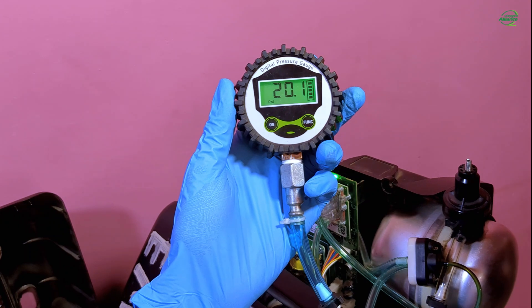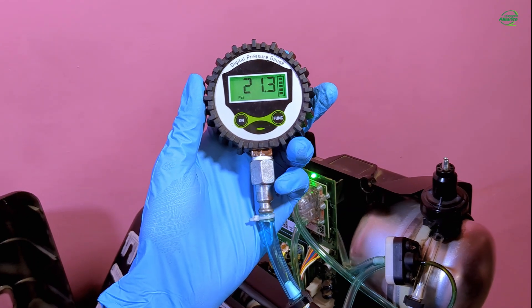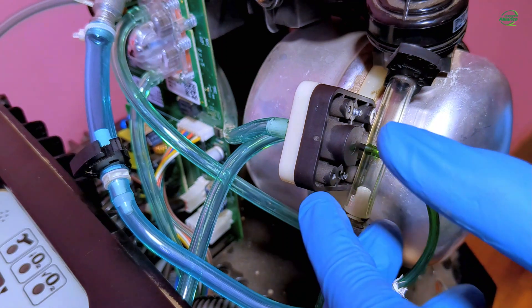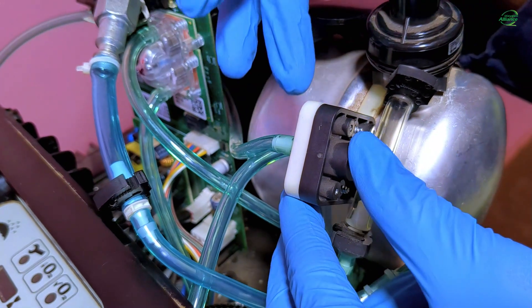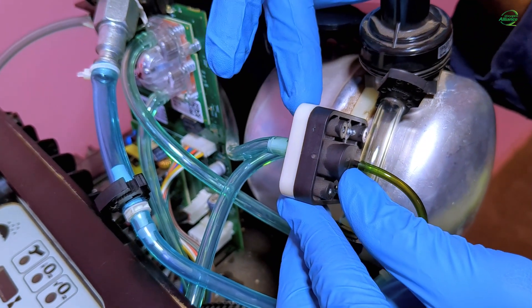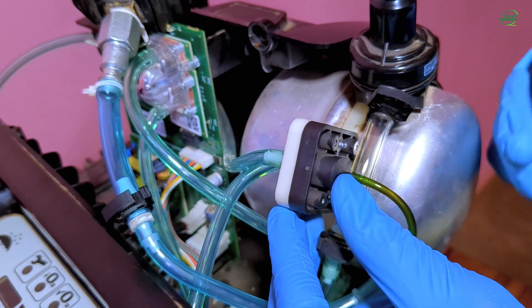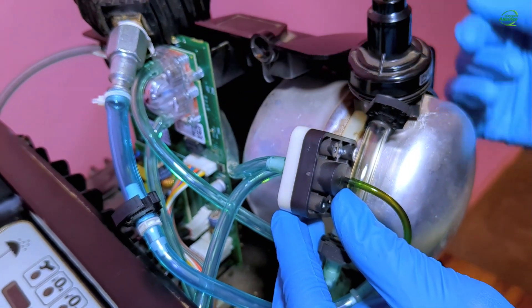Note that these pressures are affected by the type of the oxygen concentrator system, altitude, as well as the flow rate. Systems can either be high pressure systems or low pressure systems. You can differentiate a low pressure system from a high pressure system by looking at the color code on the top side of the manifold. For a low pressure system, the top side of the manifold has a white color, and for a high pressure system, the top side of the manifold has a black color. Our system is a low pressure system because it has a white top.